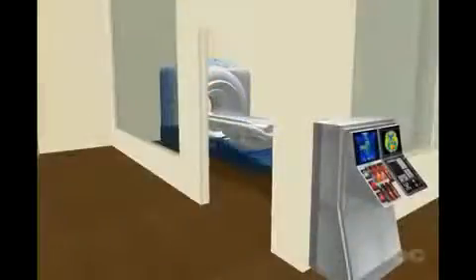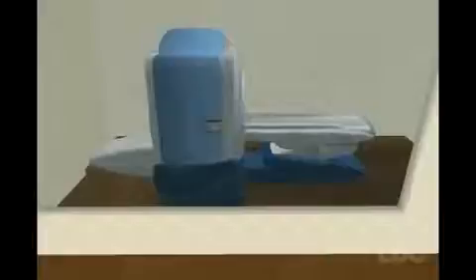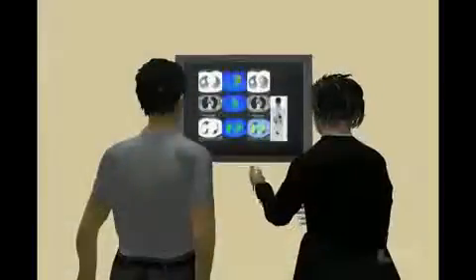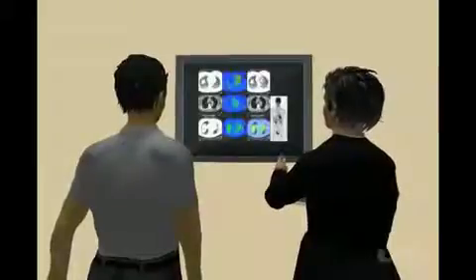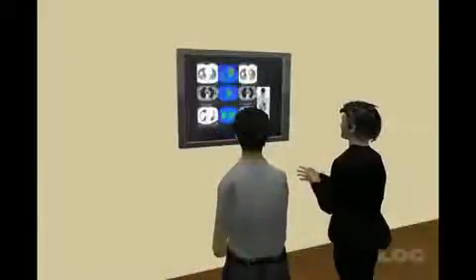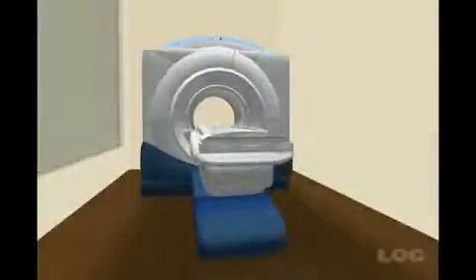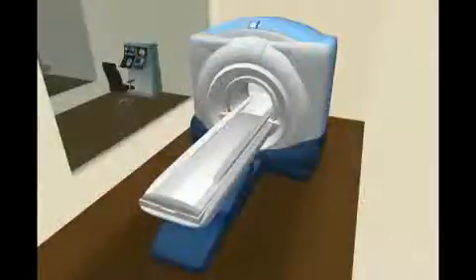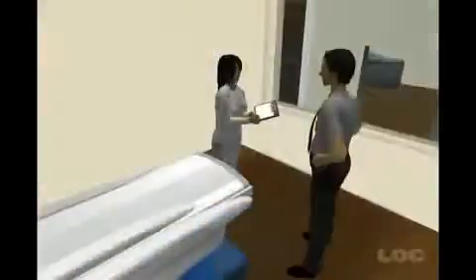A PET scan is not as good as a CT or MRI scan in giving a good three-dimensional picture of the body, and is therefore usually used together with a low-dose CT scan to help produce a better picture. Sometimes a PET scan may be combined with a full CT scan. The advantage of a PET scan is that the radioactivity helps to tell what is inside a shadow shown on a CT scan, in particular whether it is cancerous or not.